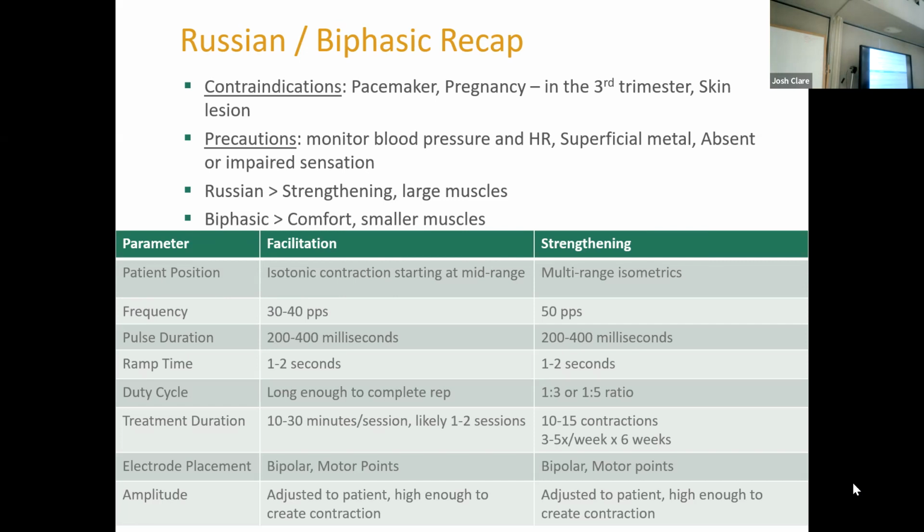You don't have to shut everything off, but you don't want any current going through the electrodes as you move it. You guys ever, or who are techs, you guys ever pull a pad off when the machine's still on? You go, whoa, that's on. So yeah, or turn the intensity all the way down. Yeah, you only need to make that mistake once.